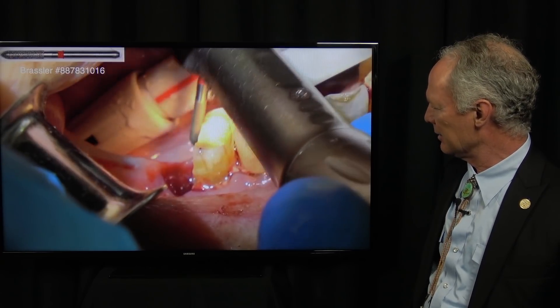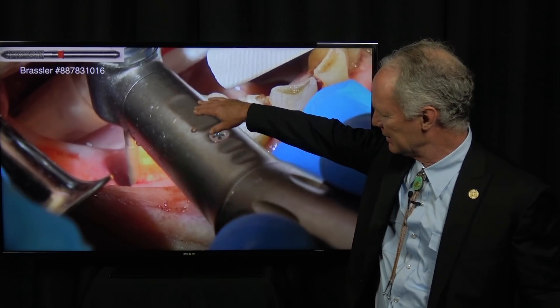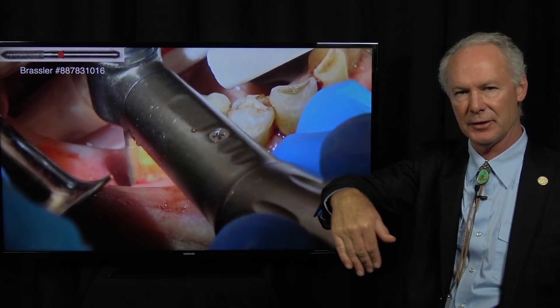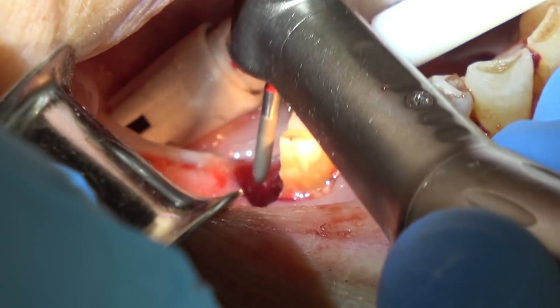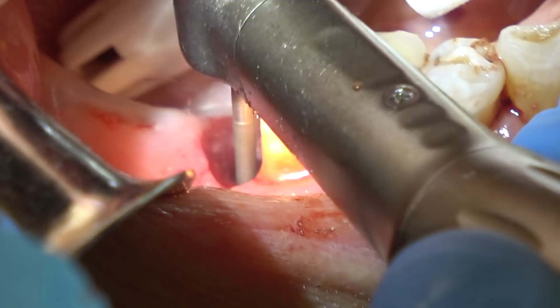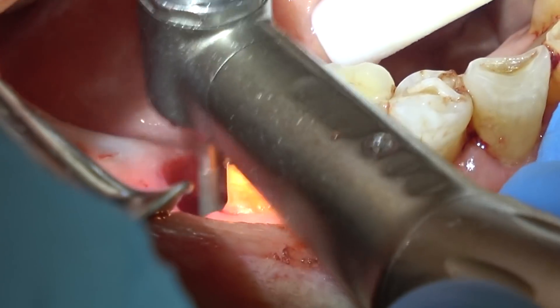Then I'm able to get my extraction forceps and remove the roots straight up and down. Then I'm going to curete out the socket and be sure that I've smoothed the distal of the mesial roots so that there's no ledge in the apical part of the remaining crown of the tooth. This is just a fine, large, chamfered diamond — high speed, lots of water. Round all the edges.